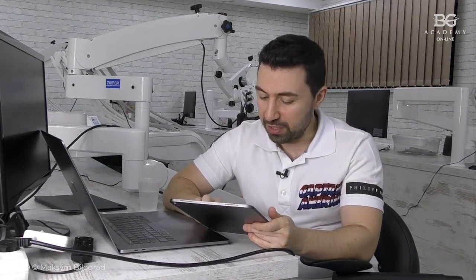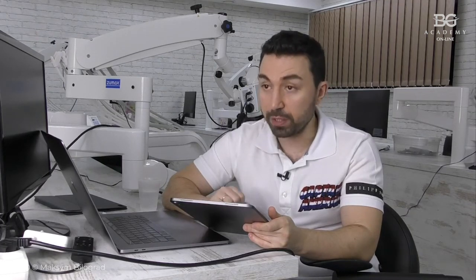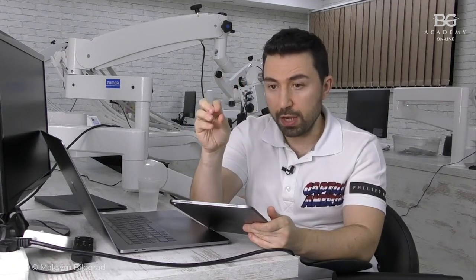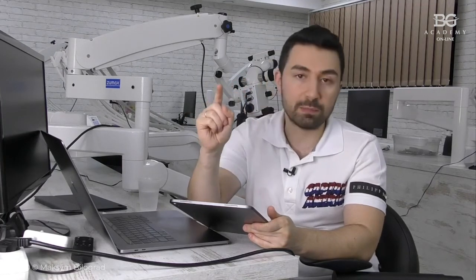How thin can we grind the ceramic veneer after cementation to avoid later fracture from occlusion? Theoretically, if the veneer is bonded to enamel, the thickness can be 0.1 millimeter.